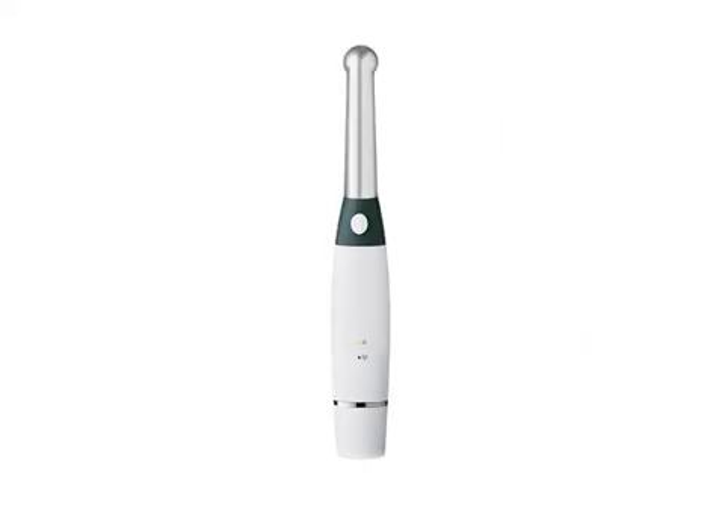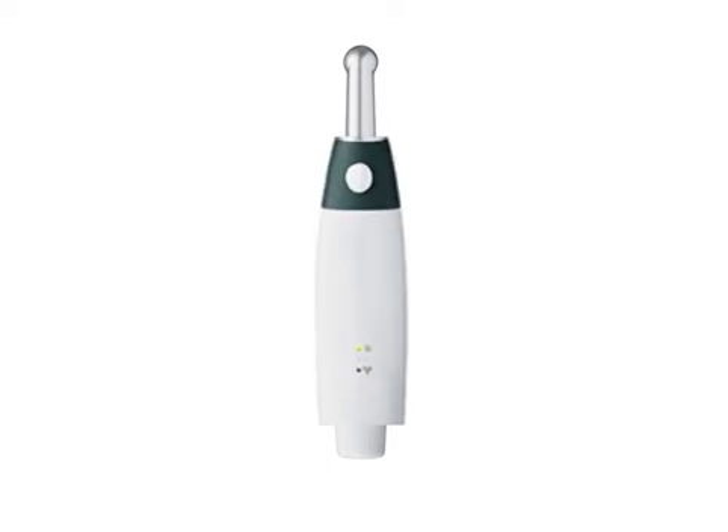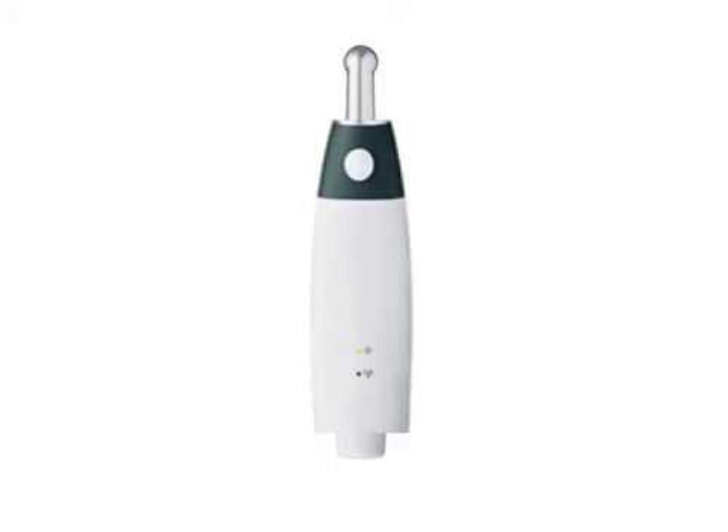The camera's case encloses the electronic components needed to capture images and video. On one side are the shutter release, the power LED, and the connection LED. The shutter release is used to capture images and video. The power LED lights when the camera is on. The connection LED lights when the connection to the dock station is working and active.